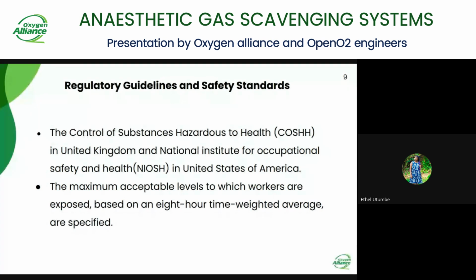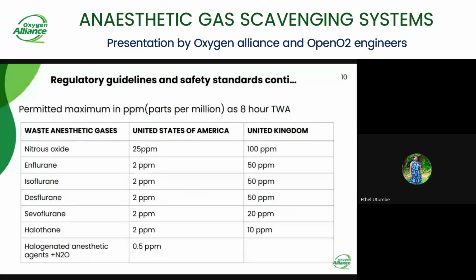That is to say, the maximum acceptable levels that a healthy worker working in an OR should be exposed to of these waste anesthetic gases. So let's see the standards. These standards differ between the United States of America and the United Kingdom.